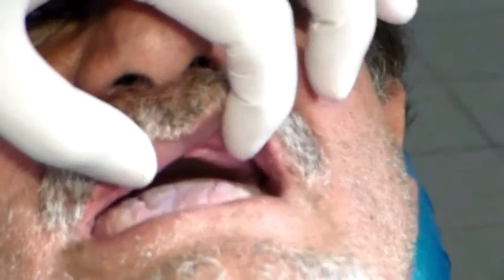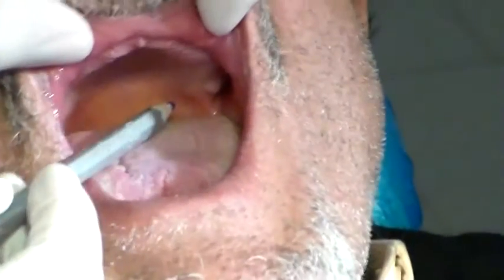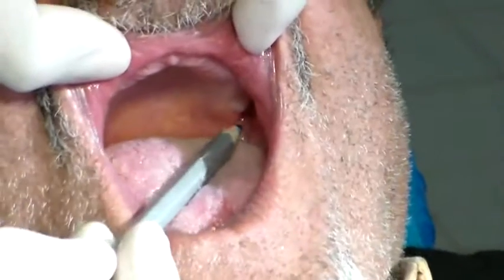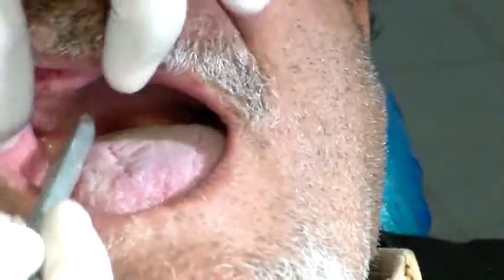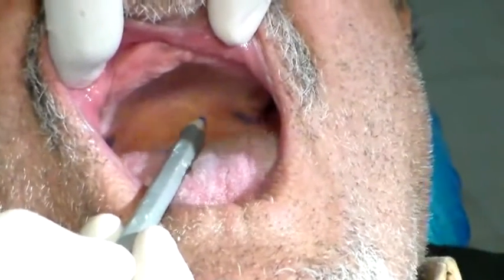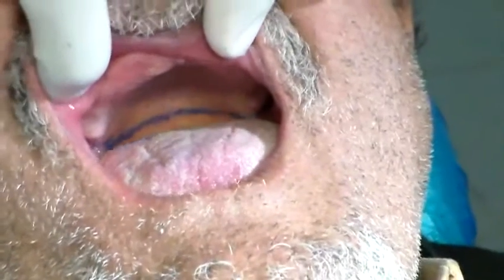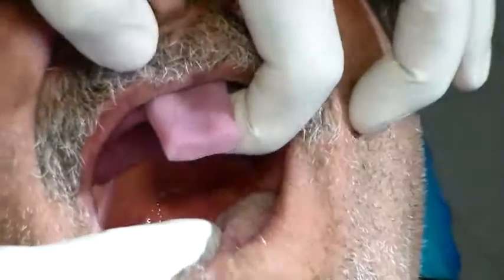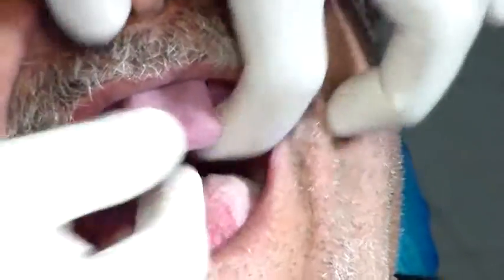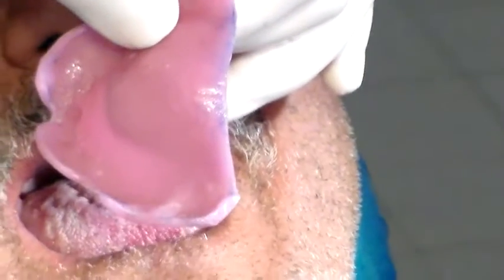As far as the posterior vibrating line goes, the posterior vibrating line comes from the hamular notch to the hamular notch going past the fovea — it's going past the fovea here. So if I place my tray and check, it's okay. I see I have my line imprinted on the posterior part of my tray, so I think I will not change that anymore.